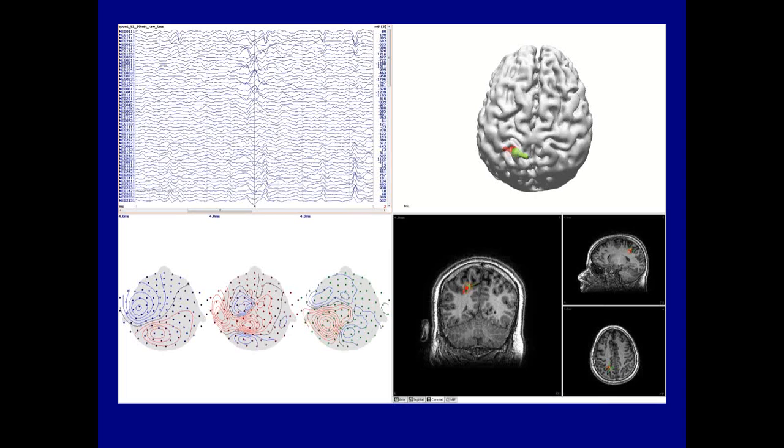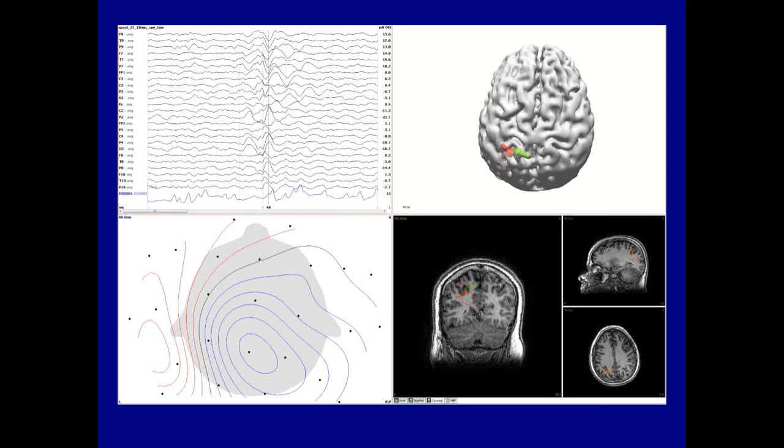So we were able to find something on MEG, even though he did not have any associated EEG. Here's showing he has both MEG spikes of opposite orientation, which you can often see. And by averaging on the MEG, we were able to pull out an EEG field, modeling here with a red dipole. So sometimes, even if you can't see the EEG in spontaneous activity, if you average the EEG based on the MEG, you'll find a complementary EEG field.